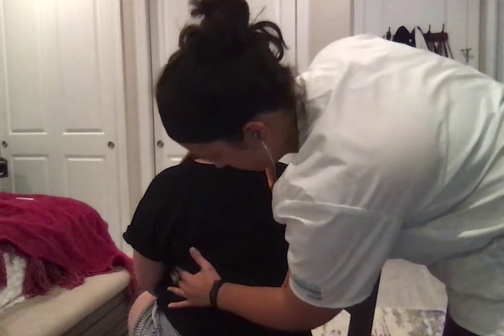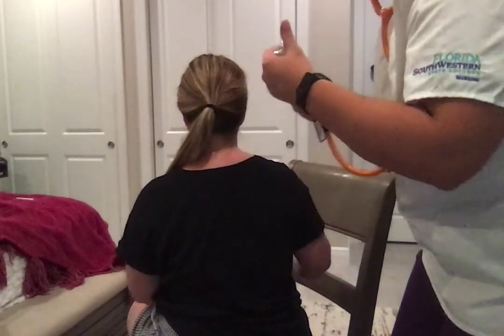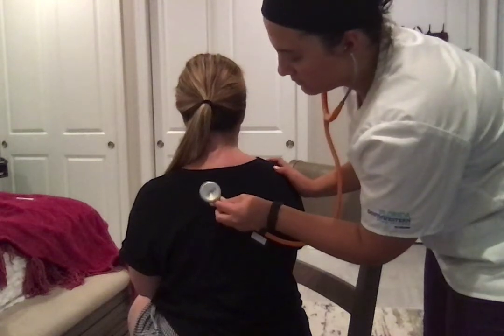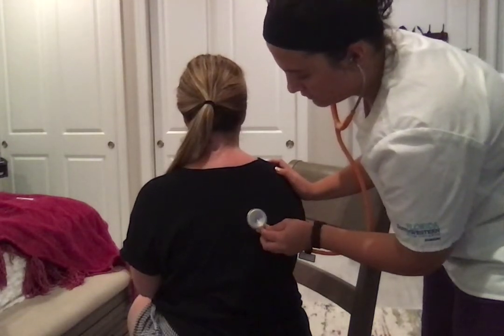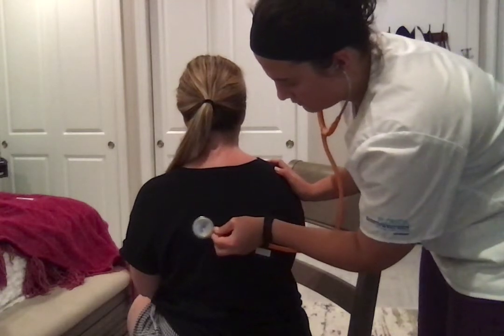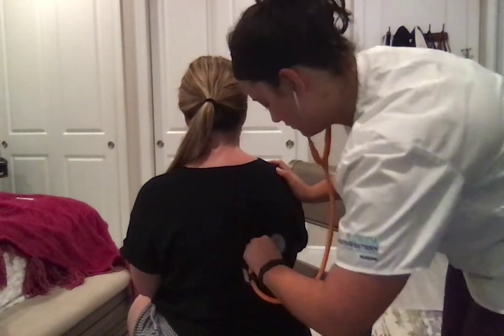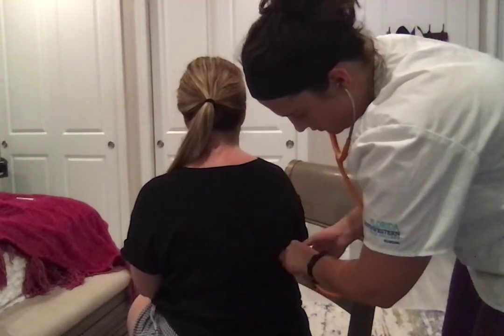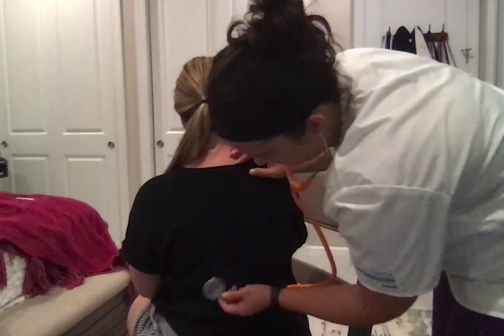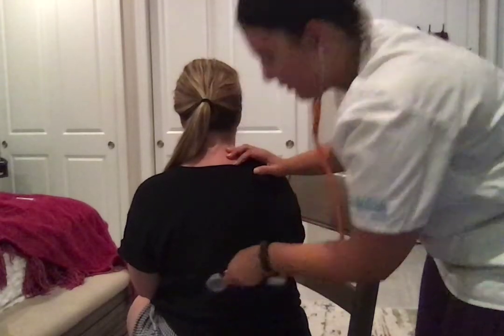Now I'm going to be doing it with the bell as well. Okay. All good. Awesome.